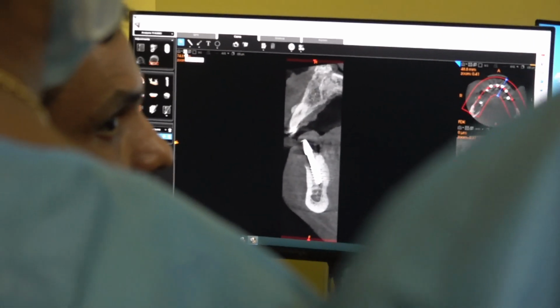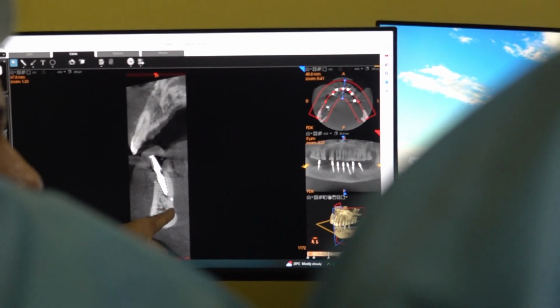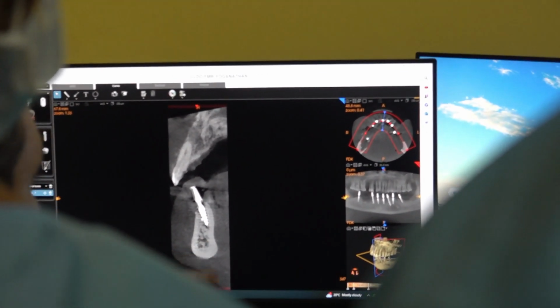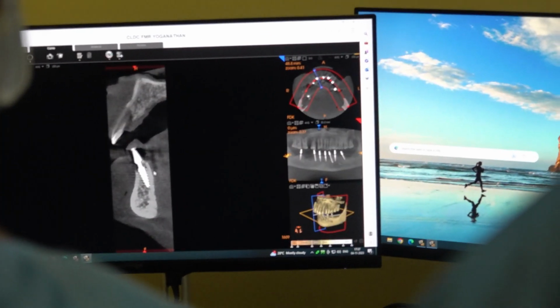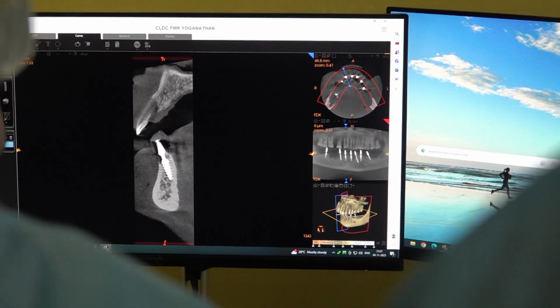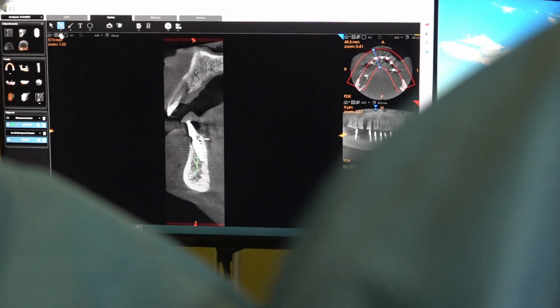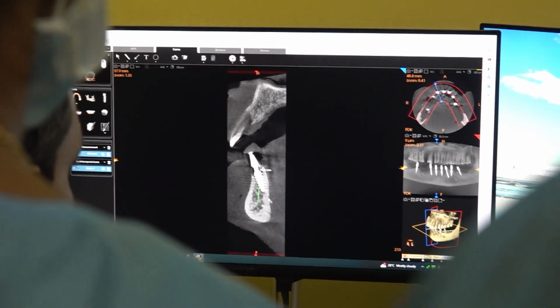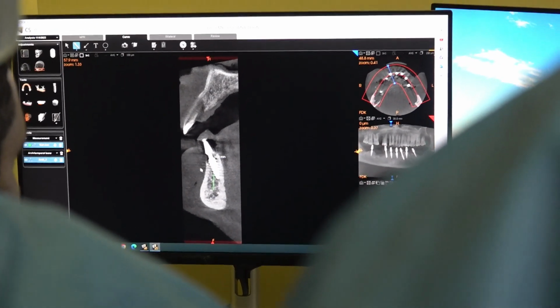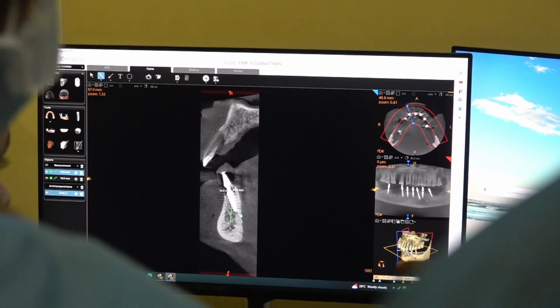What we need is stability, right? See, if you see here, I am feeling resistance because I am touching here with the lingual, right? Lingual. Here also I am feeling resistance because this is touching here. If I am drilling like this, I could have gone deeper, right? If I am not respecting this resistance, I would have perforated. Like this, over the lingual cortical.